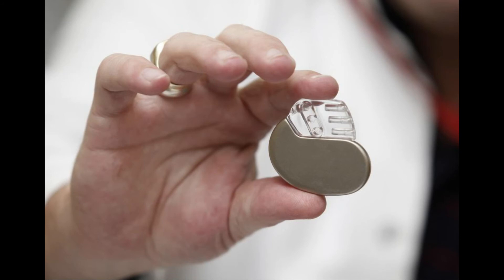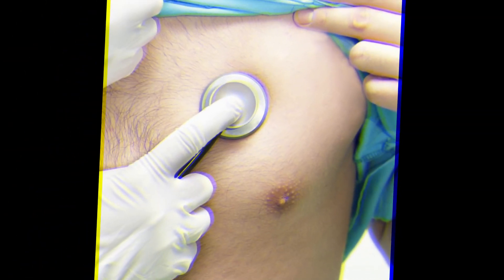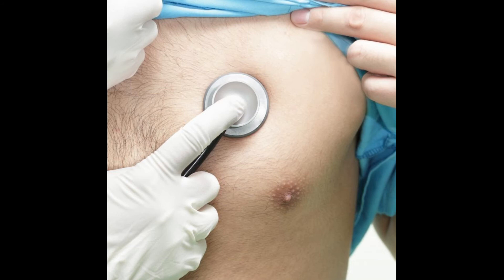Those in the DDDR family are small devices made of a powerful battery, a sensor, and at least two insulated wires, sometimes called leads, that carry electrical signals from the device directly into the heart and from the heart back to the device.